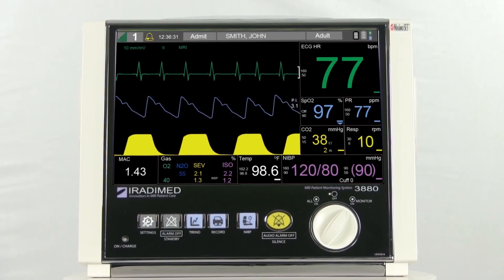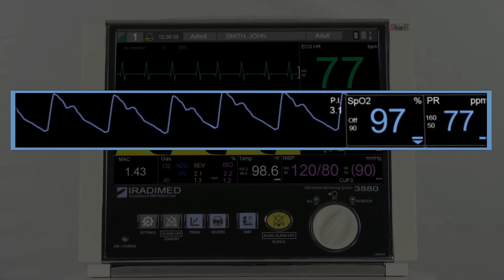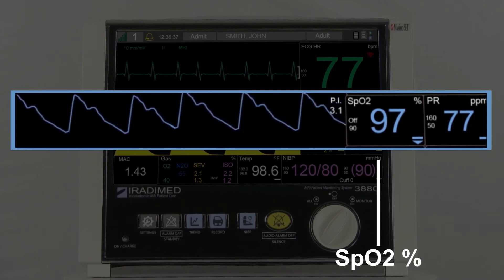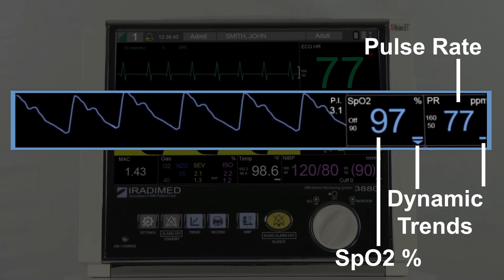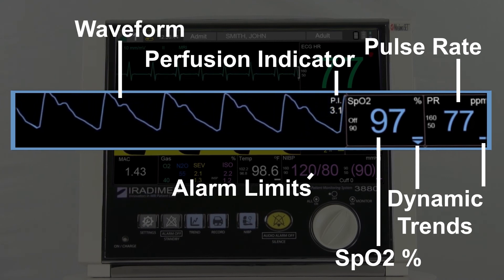The SpO2 readings will display in the blue section of the patient monitor. Here, the user will see the SpO2 percentage, pulse rate, dynamic trends, the waveform, the perfusion indicator, and alarm limits.